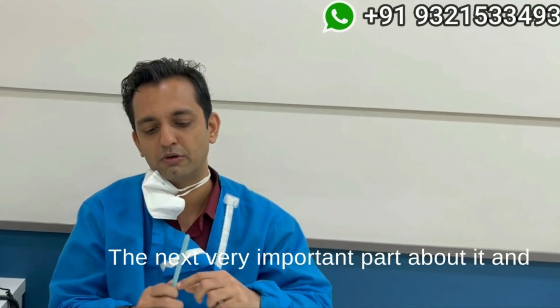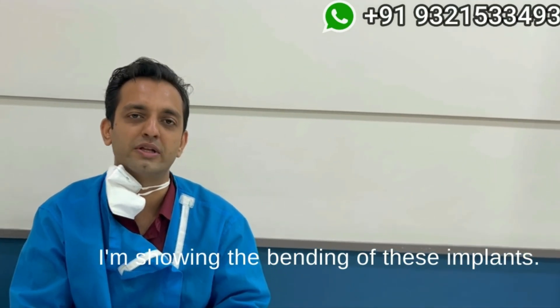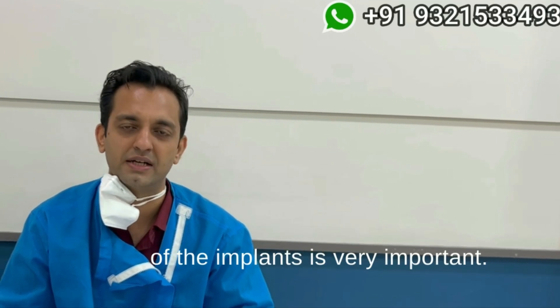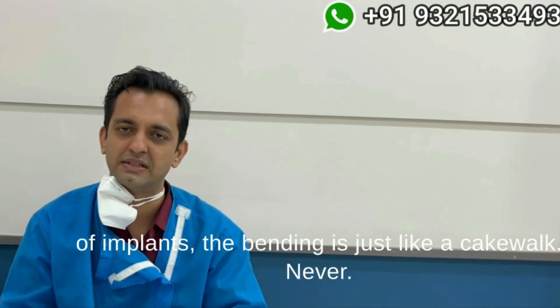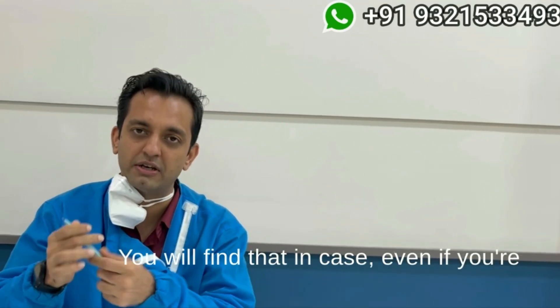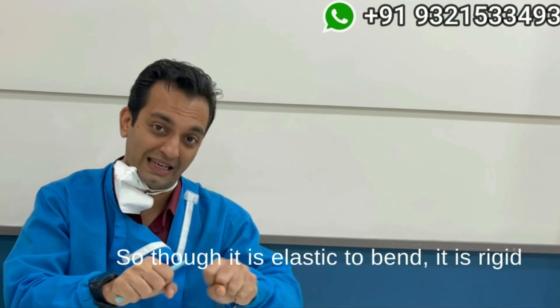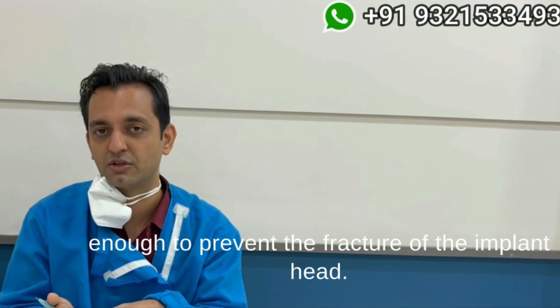The next very important part — the beauty of this implant — is the shaft. I have already uploaded videos showing the bending of these implants. For single-piece implants, bending is very important for correcting prosthetic angulation, and with the R-line series, the bending is just like a cakewalk. Even if you put in excess torque, you will never find the head breaking off. Though it is elastic to bend, it is rigid enough to prevent fracture of the implant head.